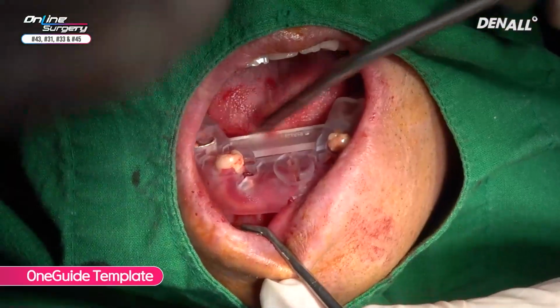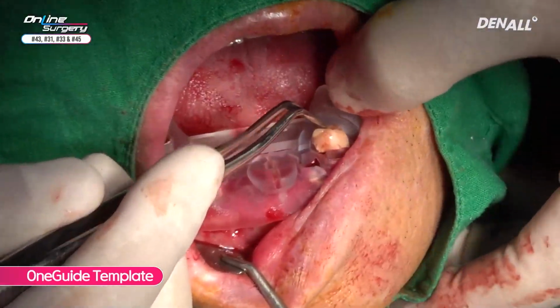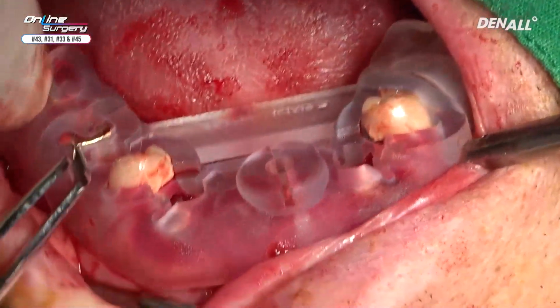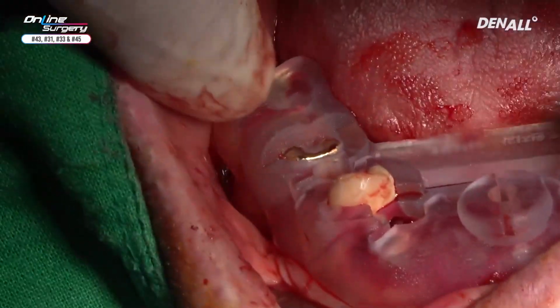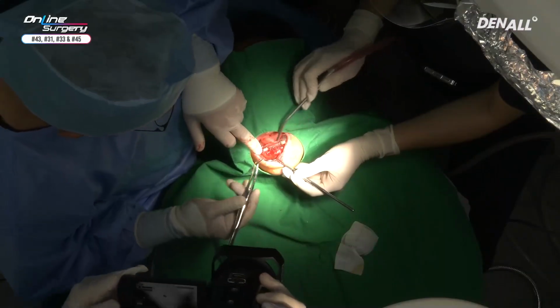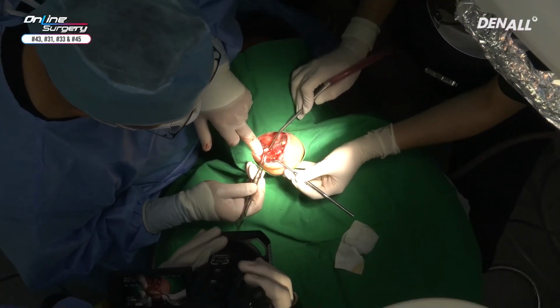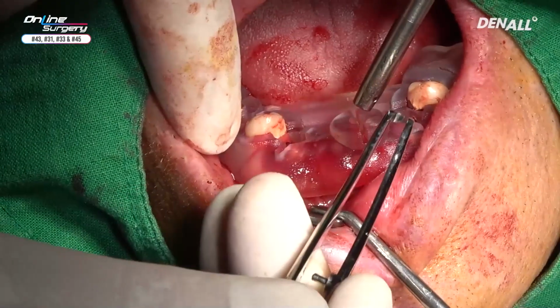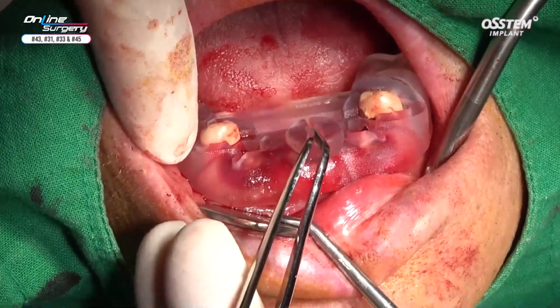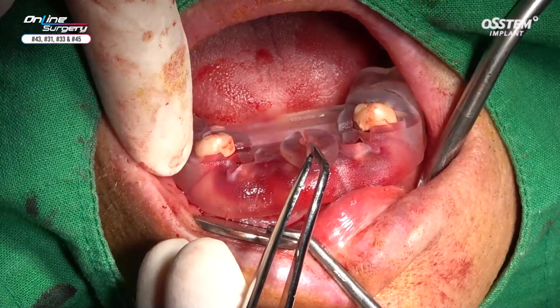What you need to focus on is here. It needs to fit perfectly. Over here and here. By having a nice fit, we can be rest assured that the guide went in. For 43, 4.0 by 10 millimeters, and for 33, 3.5 by 10 millimeters. And for this, MS implant 3.0 by 10 millimeter will be placed.